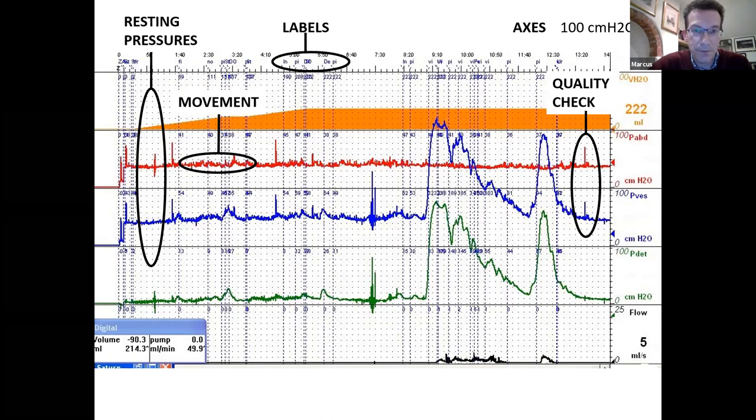At this point, you're starting to see, if only I could see my arrow, here's my arrow, you're starting to see detrusor overactivity. And that's prominently present. It never reaches a particularly high amplitude, but it's prominently present right up throughout filling virtually.